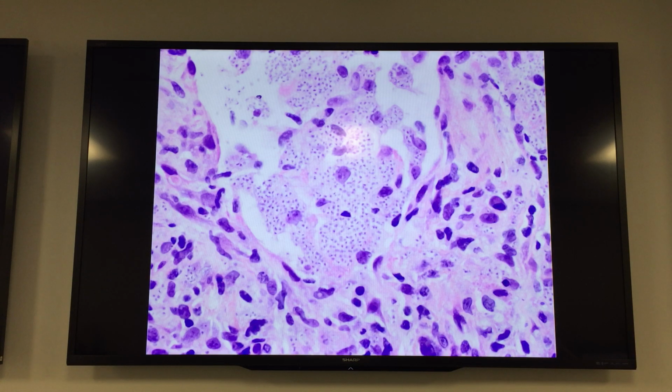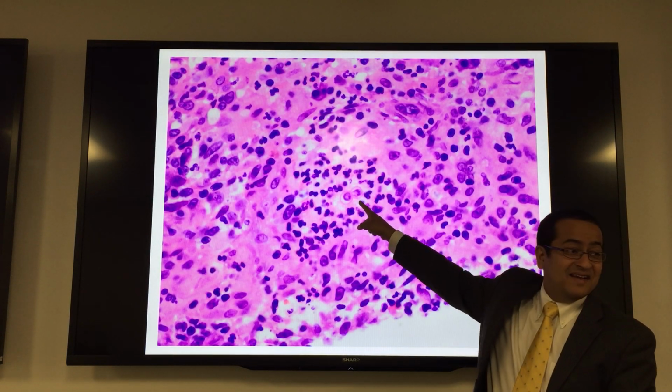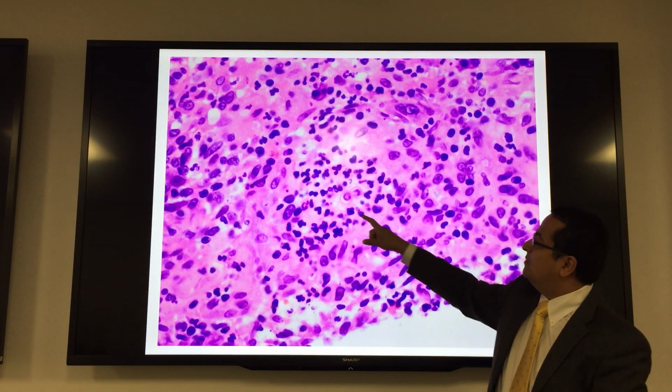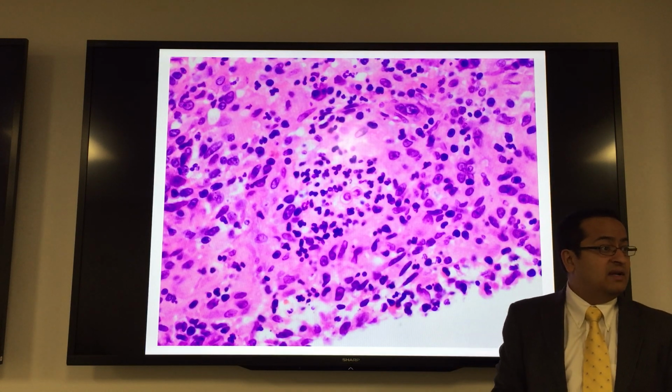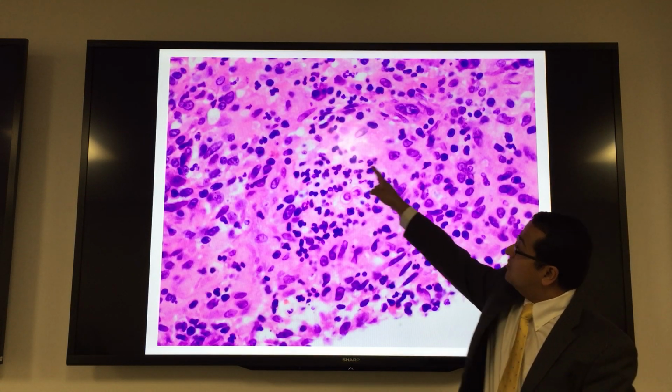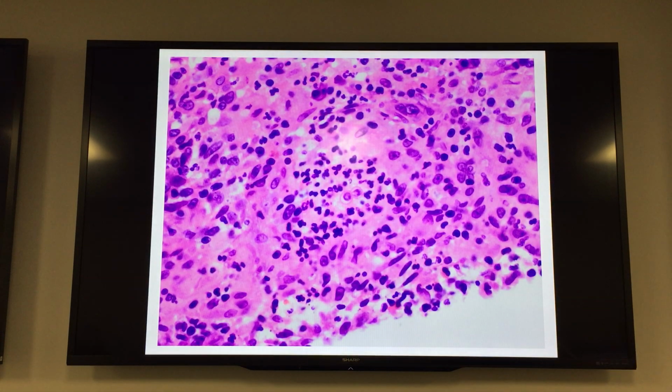This one was in a core needle biopsy, also in one of Dr. Dockstader's papers. And then, what's going on here? Does anyone see something? This is a board question. You should know this. They are budding. Yes, why do you say blasto? Broad-based budding. And one thing very few people know is that this nuclear material that's inside is also a good clue that it's blastomyces. Third thing, what cells are around it? Neutrophils. So if you have a suppurative reaction, that's also a clue to blastomyces. And this core needle biopsy made the diagnosis.